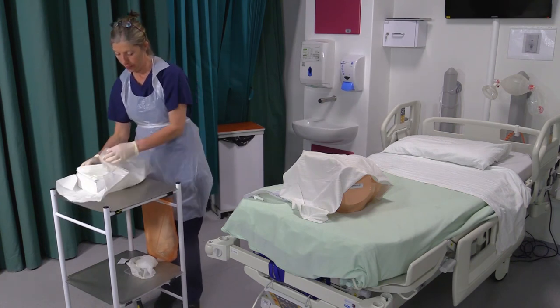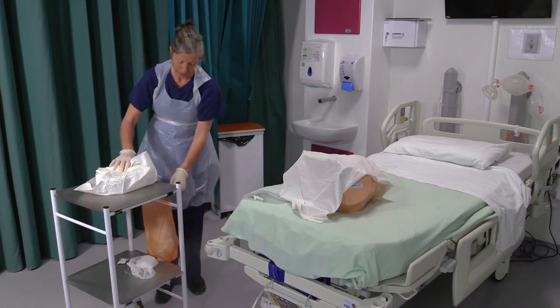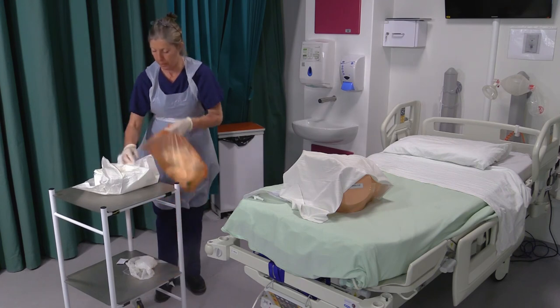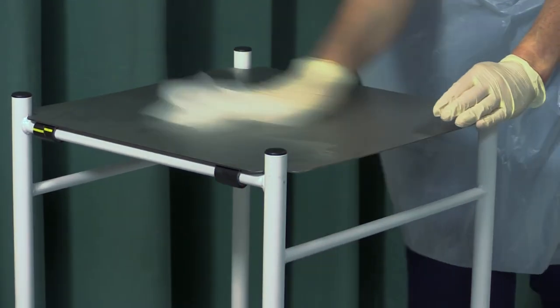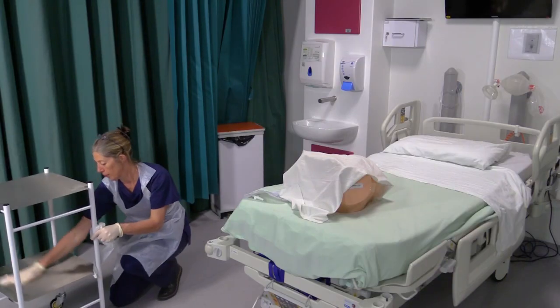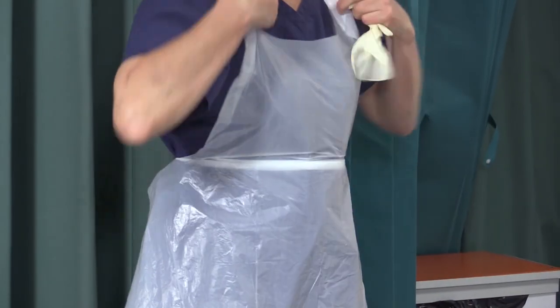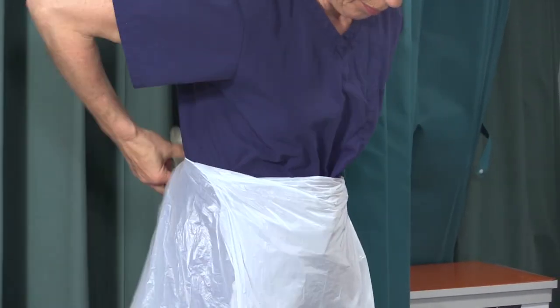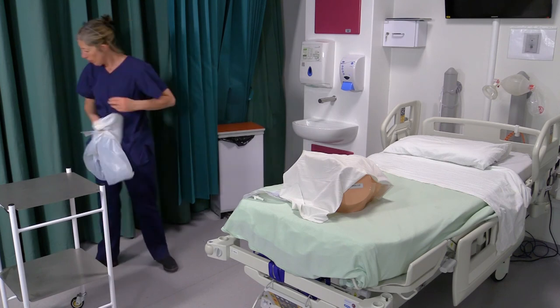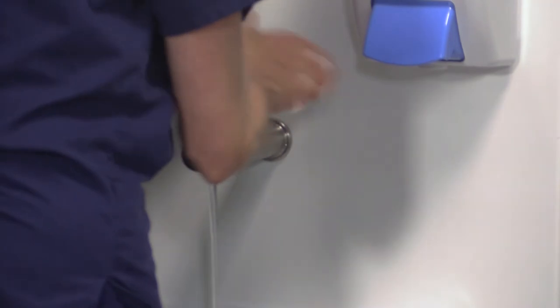Dispose of all your equipment into your clinical waste bag. Clean down your trolley. Remove your apron and your gloves. And wash your hands.